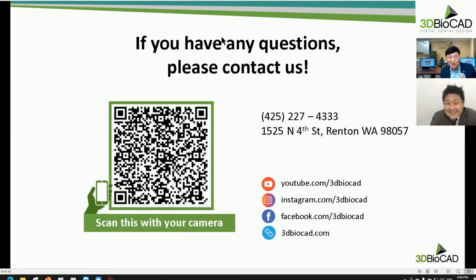And then Dr. Pong, you got a question here. Can the temporary reline be done intraorally? Okay, so with the immediate temporary, maybe I wasn't very clear. You have a shell temporary with a positioning jig that gets placed, and in the middle you have the temporary abutment that's sticking out, and those two are not touching.